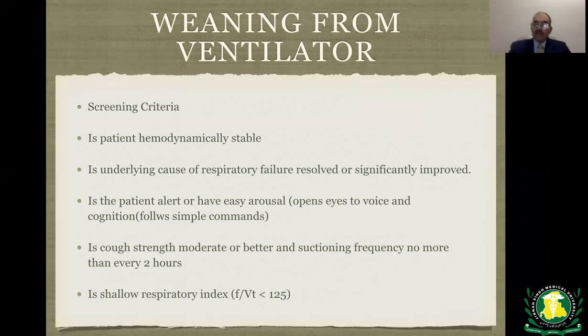Is cough strength great and there are not many secretions? And on a spontaneous breathing trial, their shallow respiratory index, that means the respiratory rate divided by the tidal volume in liters, is less than 125. The lower it is, the more the patient seems to be ready to be weaned off from the vent.